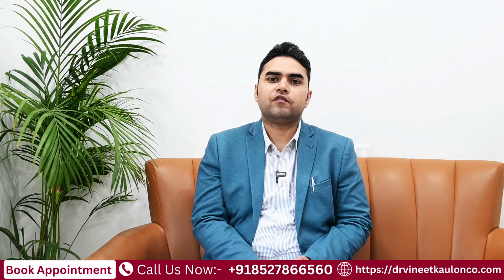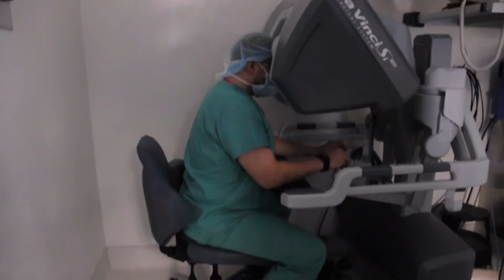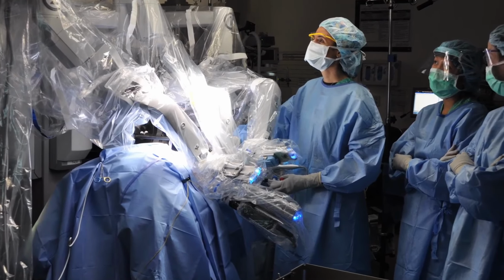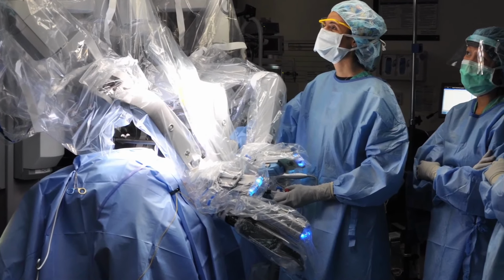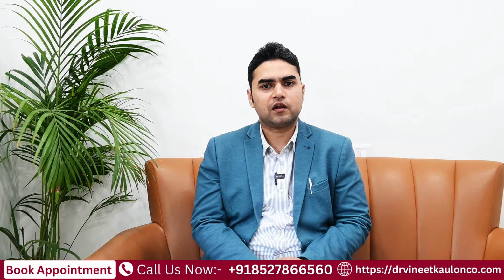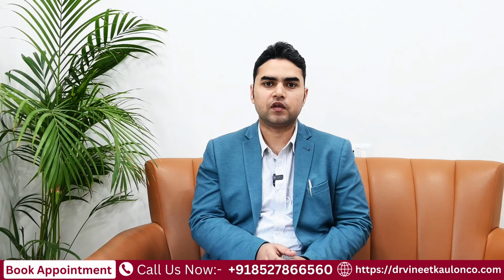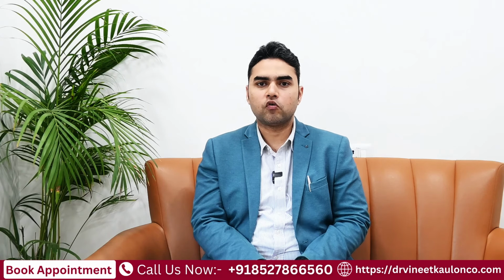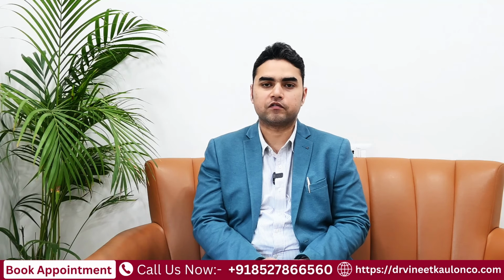Also, the identification of parathyroid glands, especially with the high-end surgical robot that we have, is easier because it has a special camera, a fluorescence imaging system built within it. It's inbuilt, and that helps to visualize the parathyroid gland separately during the surgery intraoperatively. So we can see and we can preserve the parathyroid gland during thyroid surgery. That leads to a lower incidence of hypocalcemia, which means low calcium after thyroid surgery.